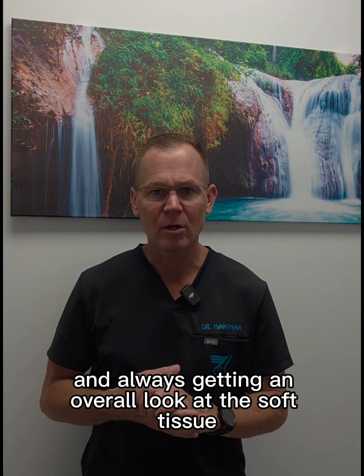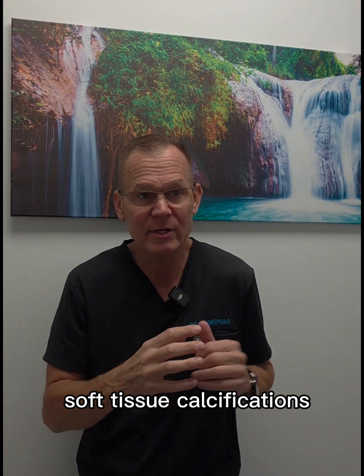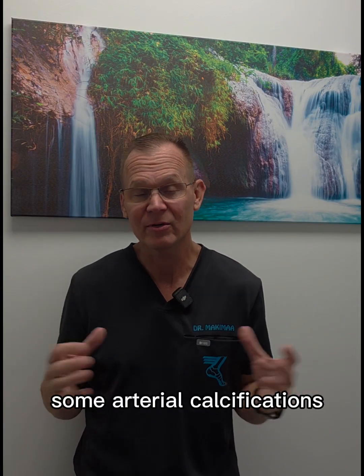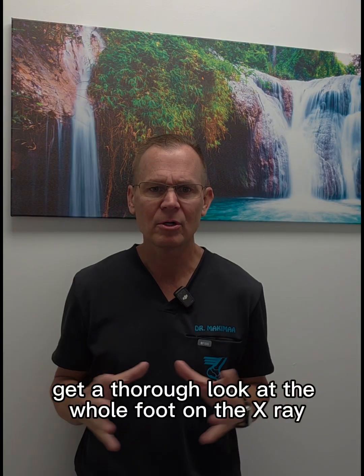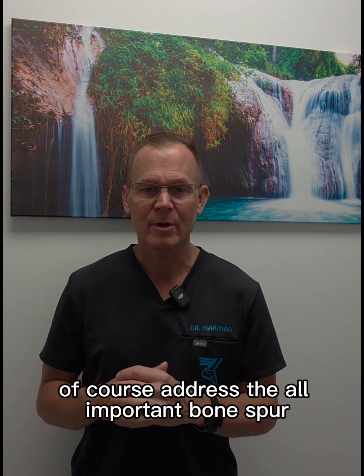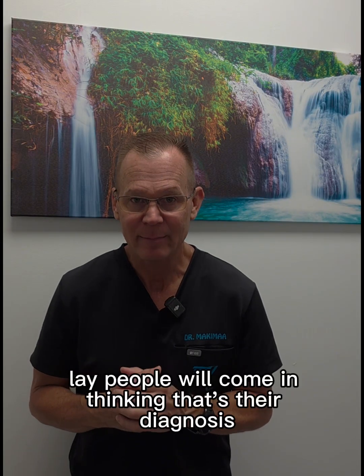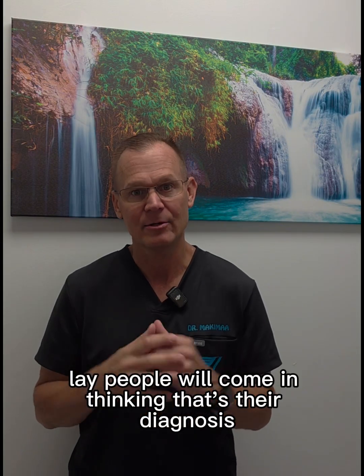And always getting an overall look at the soft tissue. Can you see some soft tissue density, soft tissue calcifications, some arterial calcifications? Get a thorough look at the whole foot on the X-ray, but of course address the all-important bone spur, which most lay people will come in thinking that's their diagnosis.